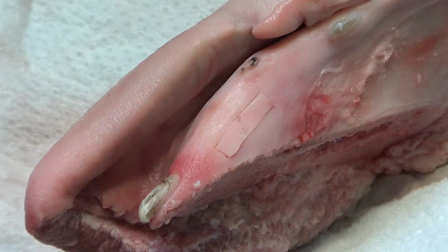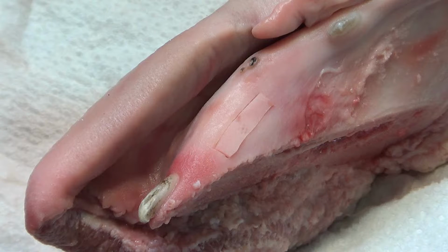If you want, just to explain this part, it's really simple, but it's part of our training. So the suture of the sponge, can we have one suture, please? Normal suture. Thank you.